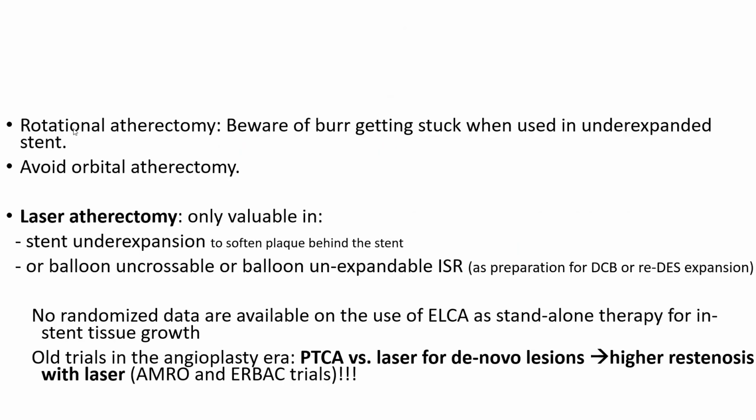Another important idea here is rotational atherectomy. So you can use it in stent underexpansion, but beware of the burr getting stuck when using underexpanded stent.